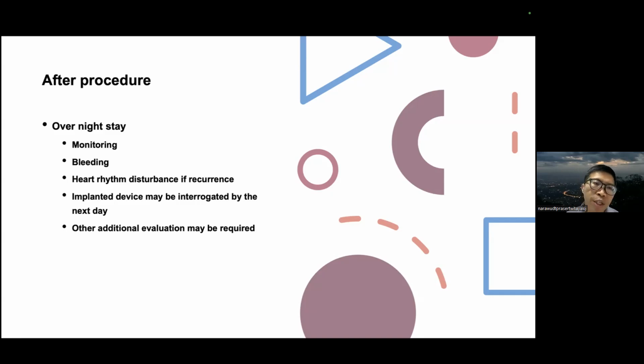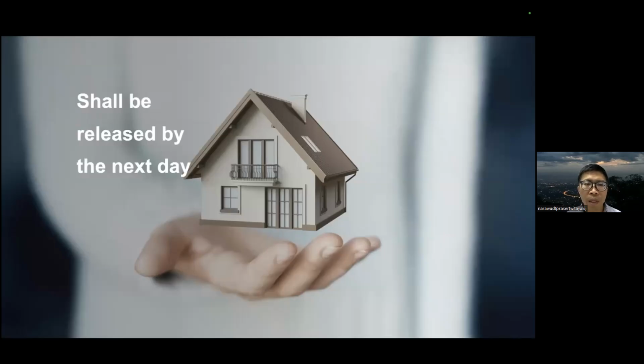After the procedure, you need an overnight stay for monitoring, bleeding observation or surveillance, and heart rhythm disturbance if it is recurrent. Any implanted device may be interrogated by the next day, and additional evaluation may be required. Commonly, we will release you by the next day.